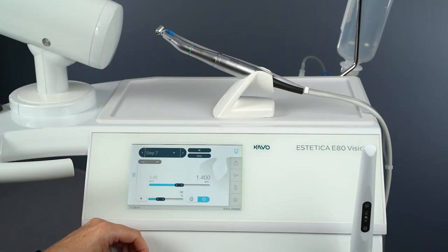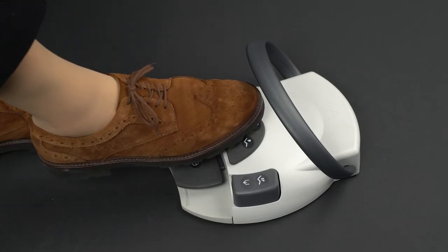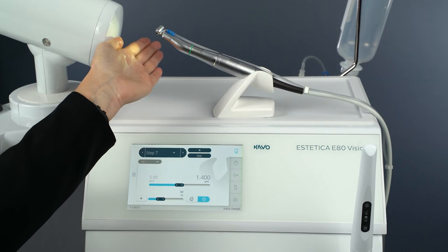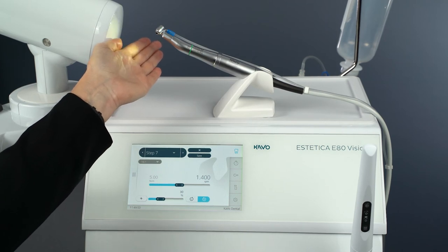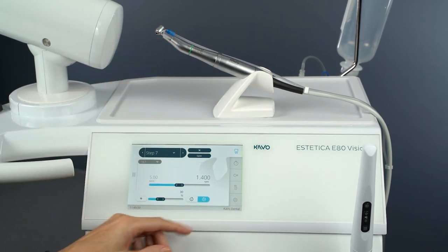To activate a spotlight with no motor and pump running, slide the cross button of the foot control to the right. The spotlight only lights up when the cross button is pressed. In the settings, the instrument light function can be selected.